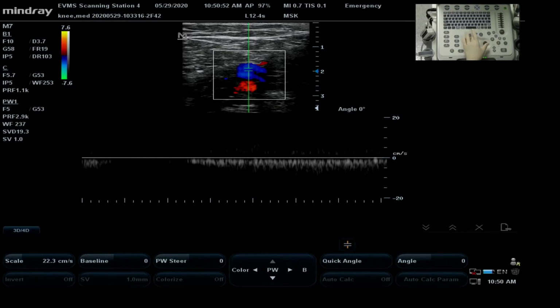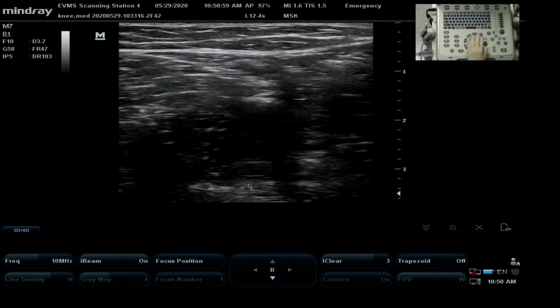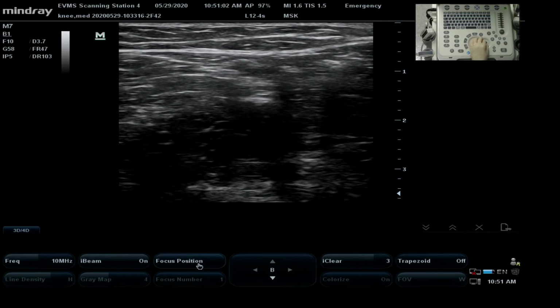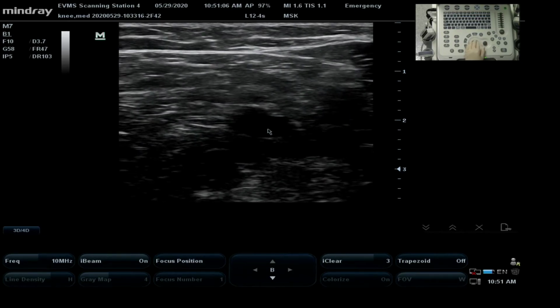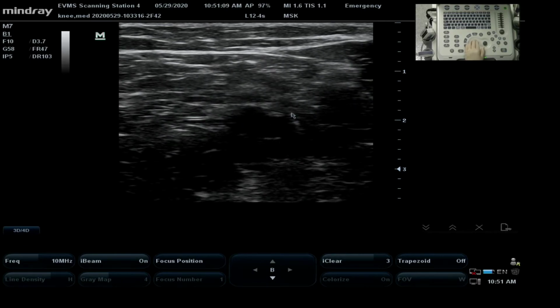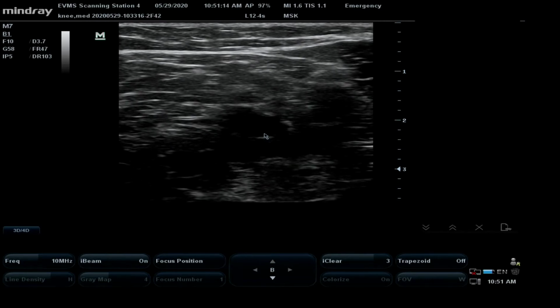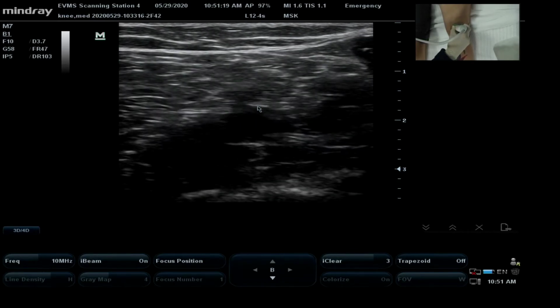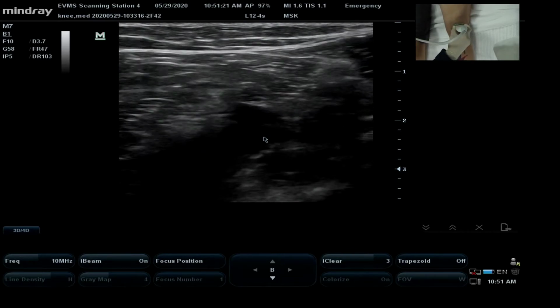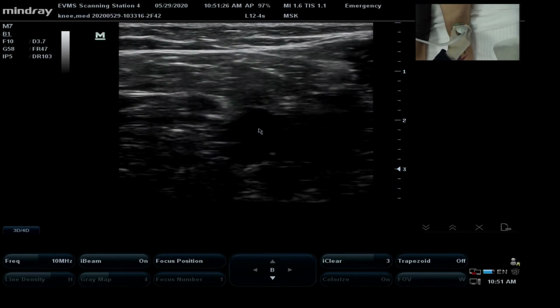So now that we've established which one is the vein, which follows what we look at when we're looking at these structures from an anatomical point of view, when we're doing our dissections. Let's go back into it. There we go. So here are two vessels. The important thing to establish is that this vein collapses with pressure. So I'm going to add pressure, and you're going to watch this vein, the walls kind of kiss each other. So I'm going to press down and look at them kiss each other. I separate. That tells me right off the bat that I do not have clot in this vessel.